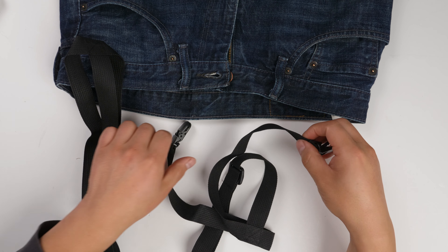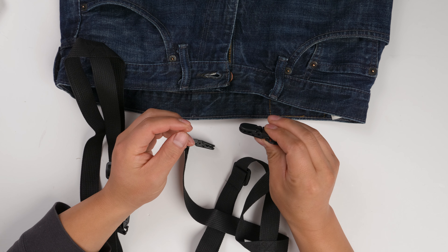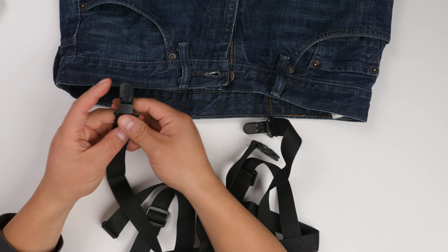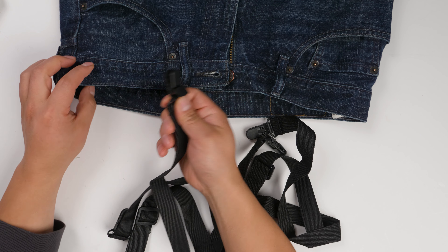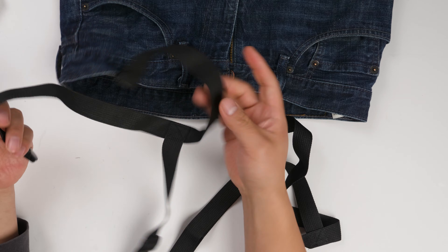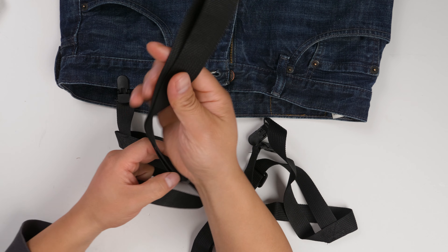It also comes with straps. These straps come with a little clip that can actually grab the pants. Just like this — this is pretty easy. Open it up like this and you grab it and clip it. Each of the straps has a hook.